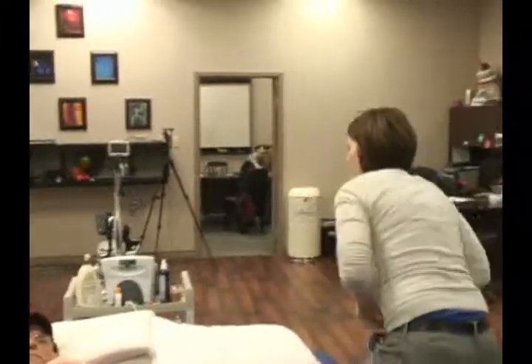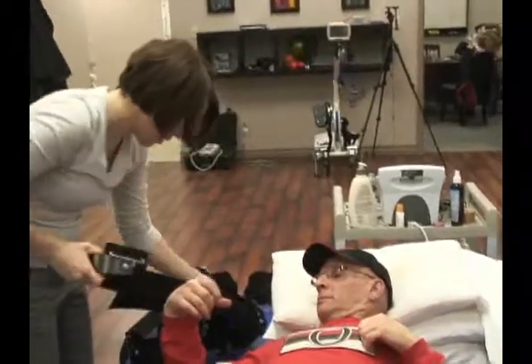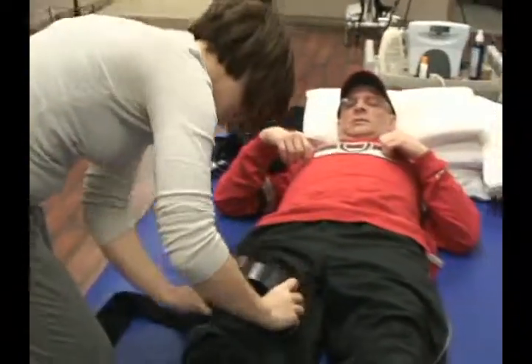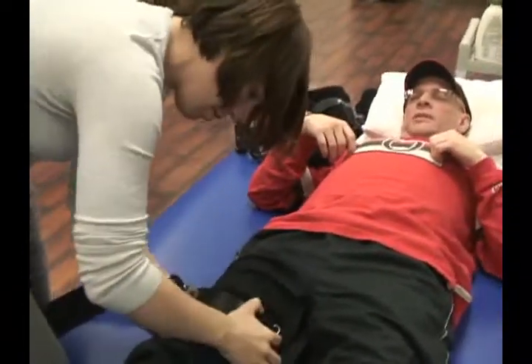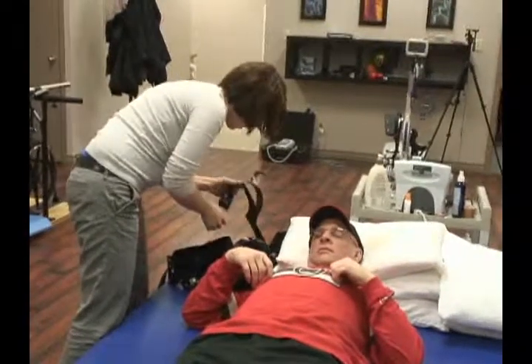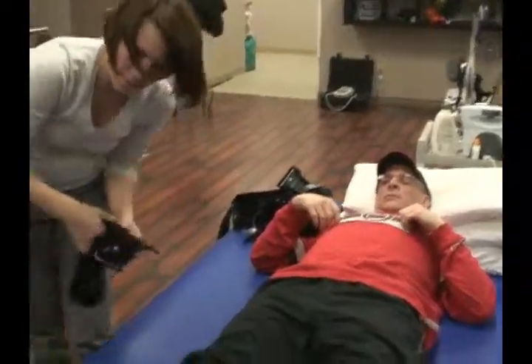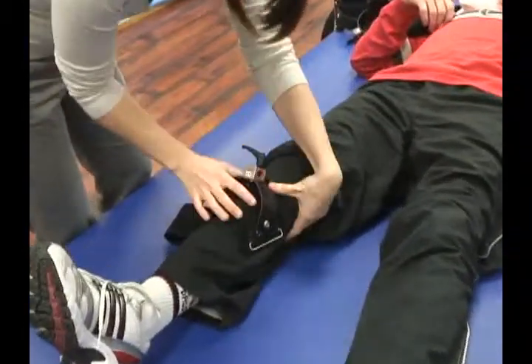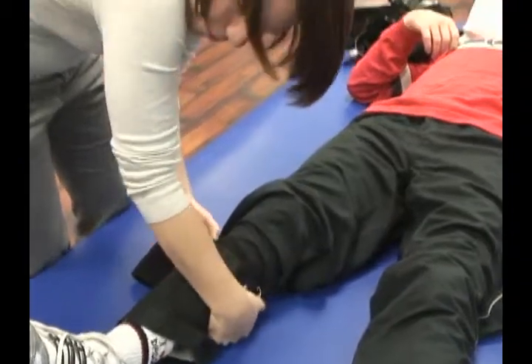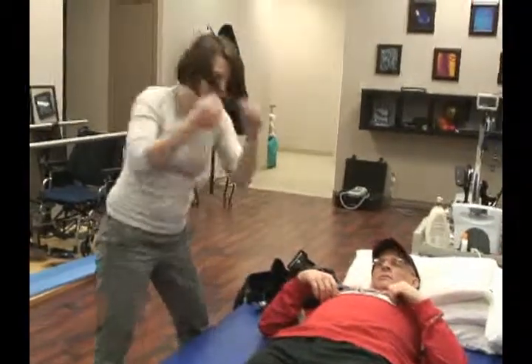And then we use the cuffs to keep you in. We just need to measure the cuffs to the circumference of your leg. An eight on the quad — nice, that feels good. An eight. Five for calf, and it will be a four for ankle. That's as simple as ever.